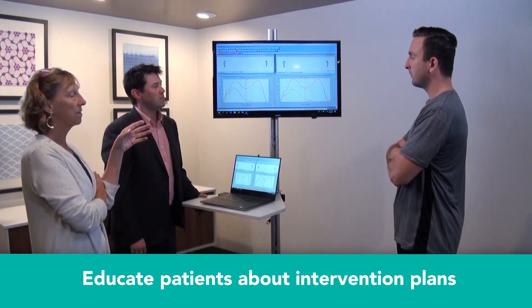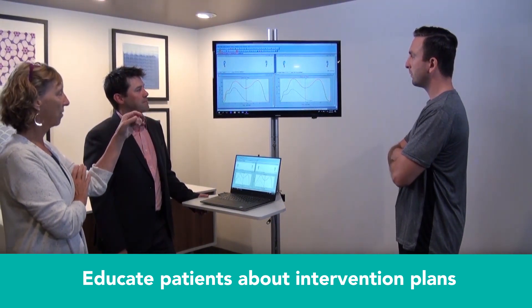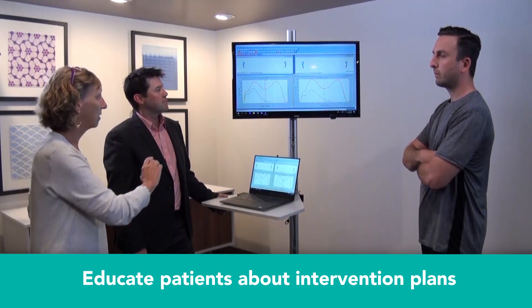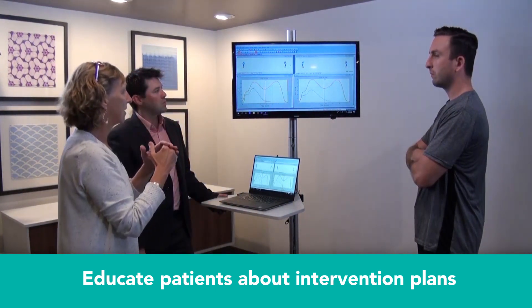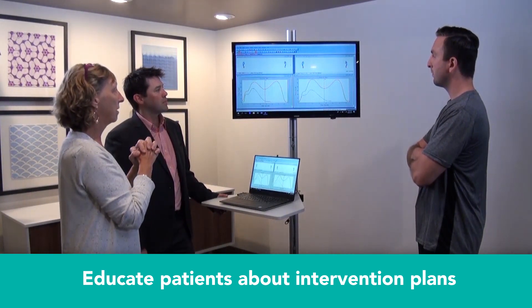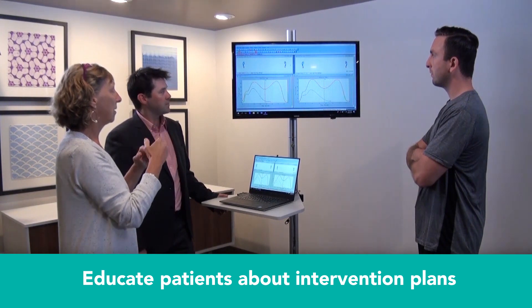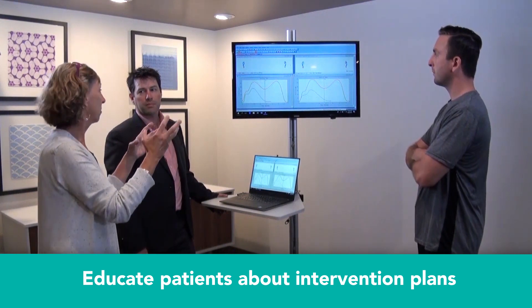I think the adaptations are subtle enough that you may not be able to see them with your naked eye. Having the curves like this to be able to identify the shifts in the pattern is really important. Even on this one, where it's not at the same peak as the other, the timing of the peak is improved — and that was just with a short intervention. These are incredibly helpful to confirm that you've made a change in someone's movement pattern and overall motor control system.